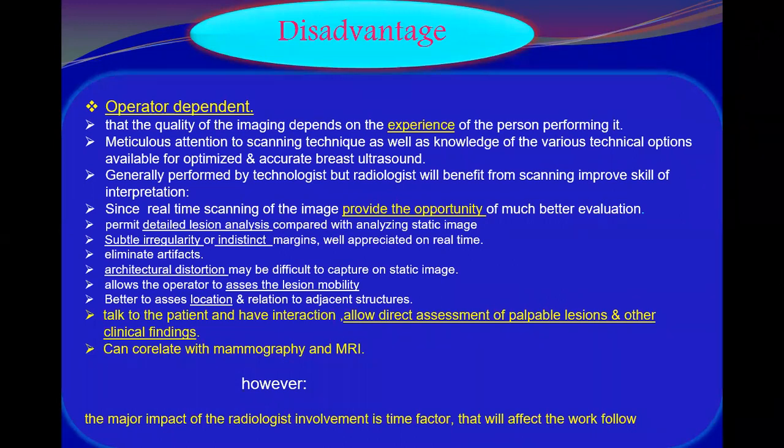This capability will be difficult for the technologist. However, definitely this scenario has a major impact through radiologist involvement, by the time factors, and it will affect the workflow.